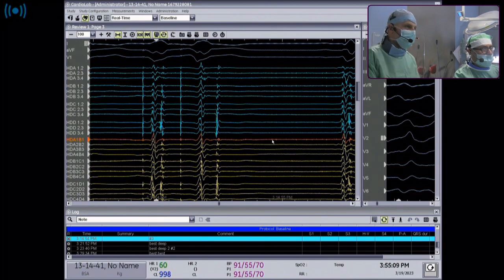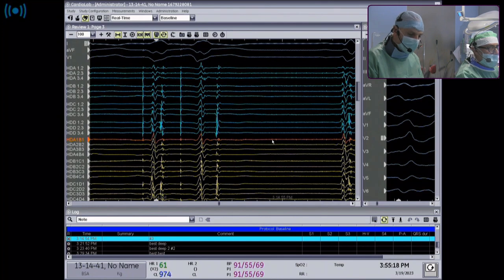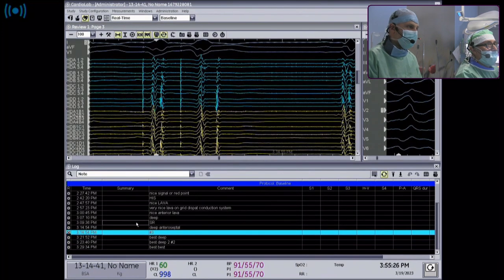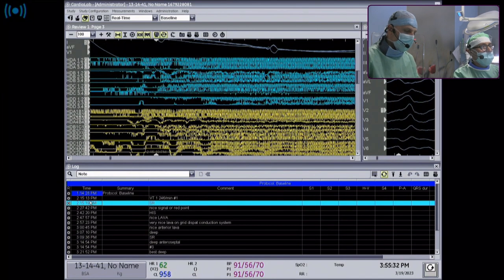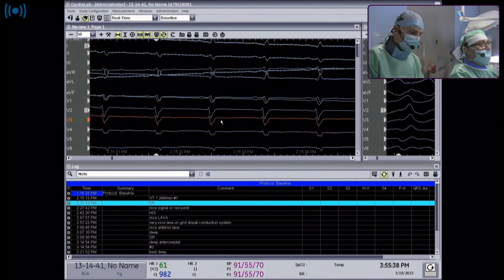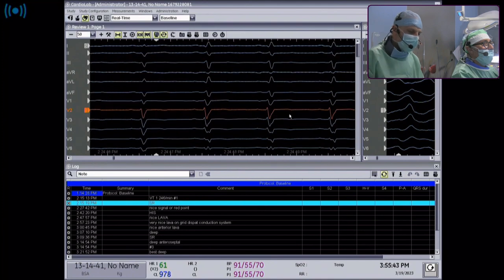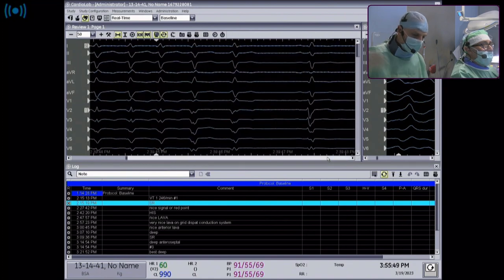The blue areas are the most delayed. Also worth noting: the patient came with non-LBBB, but after some mapping with the HD grid the QRS got wider, which is an unfortunately common situation. It's better to map and annotate the conduction system before further mapping. The aim here is not to create permanent LBBB because then you would have to upgrade the patient, which may really deteriorate him hemodynamically in the longer term.